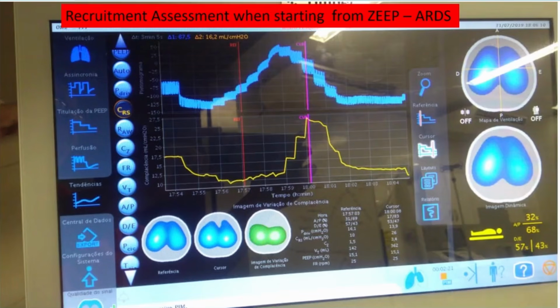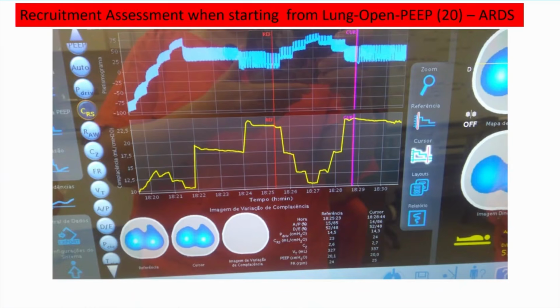And we tested this with EIT, again, a patient that had a drop and then a big increase in compliance. And then we measured this gain in compliance and tried to correlate it with the amount of collapse reversal. Again, this is a case where there was no recruitment. Let's see what we found.